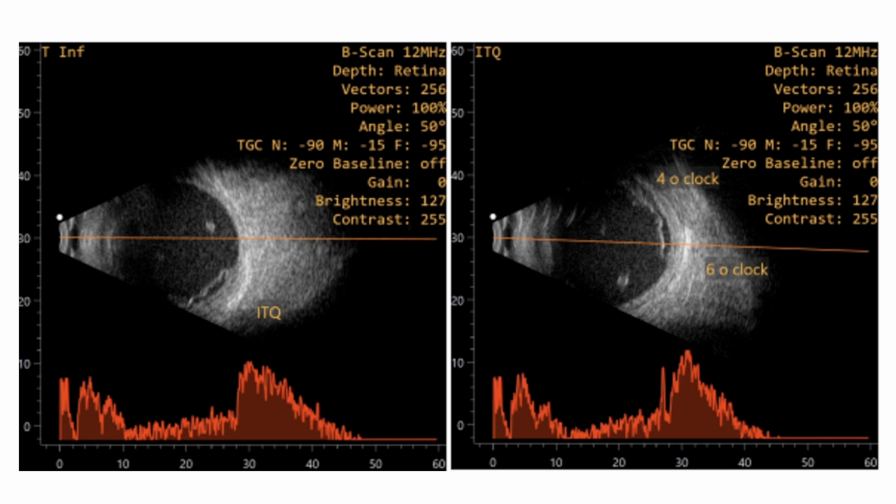Why is the retinal detachment like this? Ma'am, in the next image we can see there was a subretinal abscess in the temporal quadrant itself, and we were suspecting that the subretinal abscess has given way, and there was a retinal break temporal to the macula. So maybe the subretinal abscess has burst out, and the retinal detachment happened there.